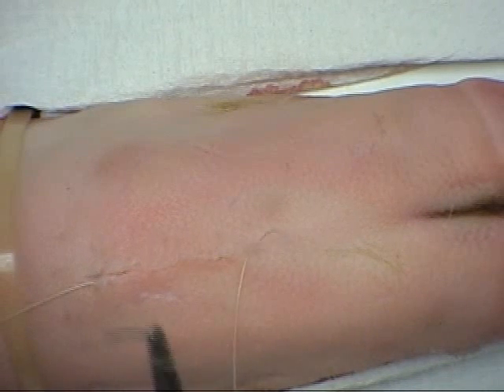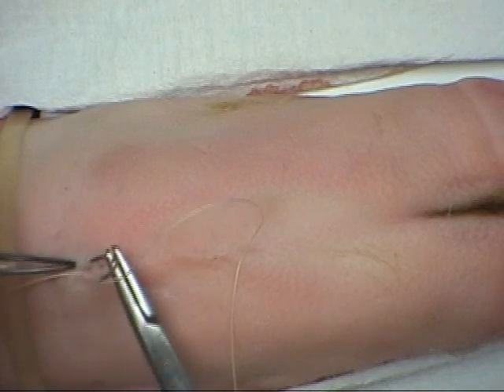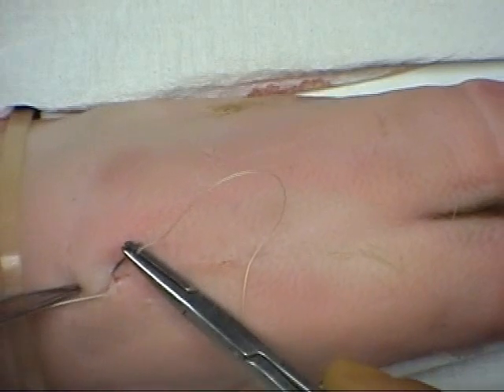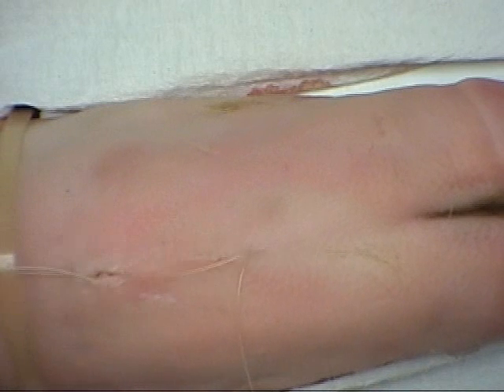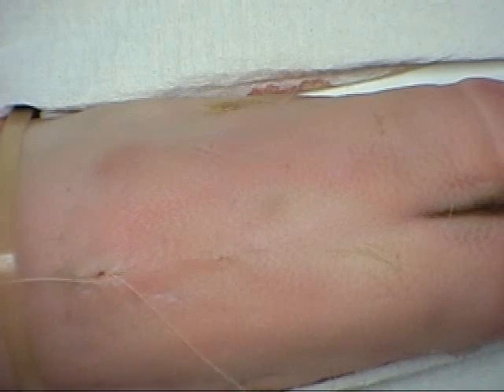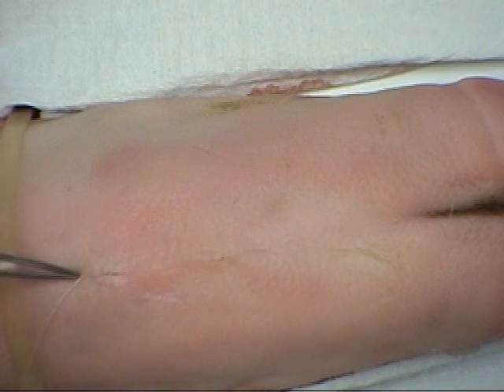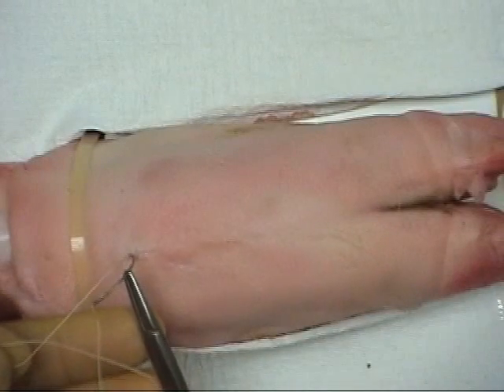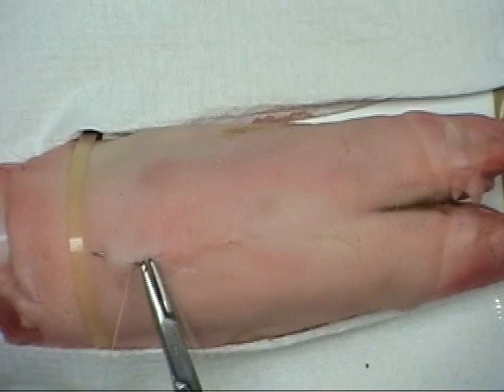Once the other end of the wound is reached, the sutures will be quite superficial and it will not be possible to place a deep knot. A superficial knot at this point will erode through the skin surface and produce a small stitch abscess, reducing overall cosmesis. Thus, to complete this closure, the needle is reinserted at the apex and driven through the tissues to emerge distal to the wound.